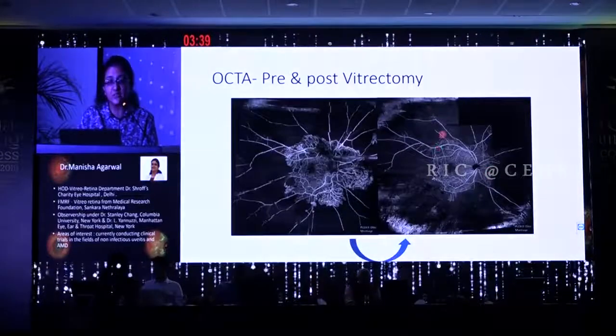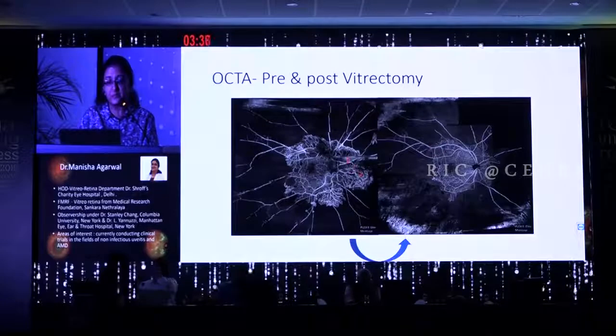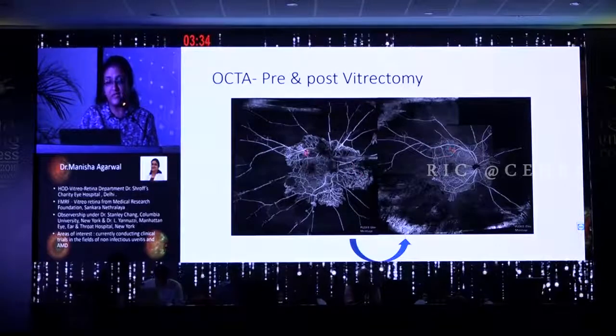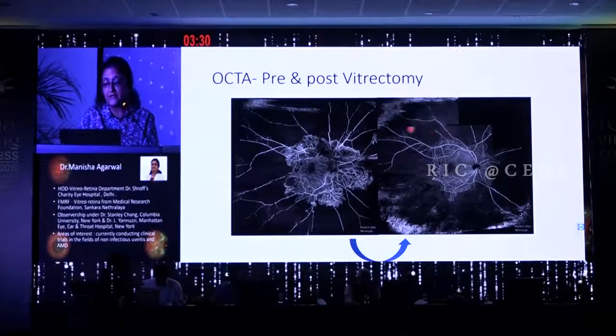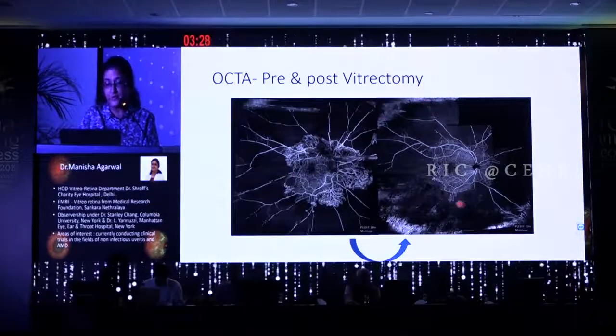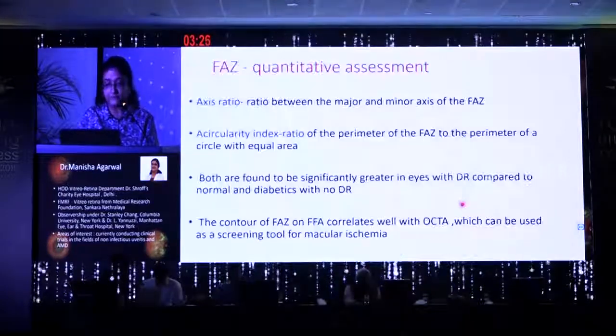This again you can see the response to treatment. This is pre-vitrectomy, and this is again post-vitrectomy. You see there's a marked regression again of the neovascular front over the disc, and there is also an extensive capillary non-perfusion which is present all along.